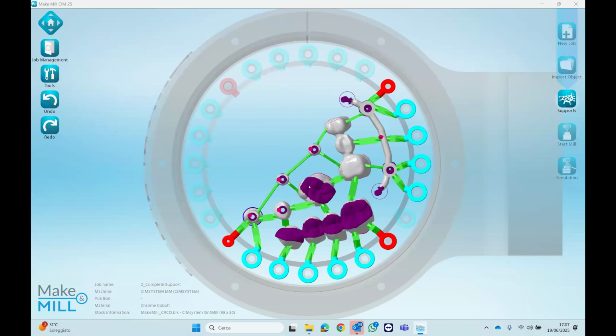we are ready to proceed to create the printable files optimized for laser melting or similar technology and for the toolpath generation. These files can be used for other printing output software, or they can be directly input to Pyramis, which is another of our software, with a single click, because the two systems are fully integrated, okay? So let me show you here.